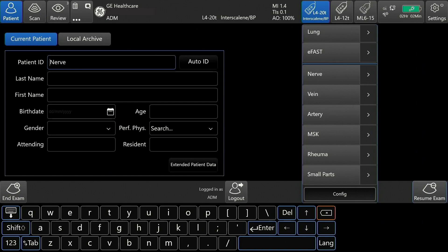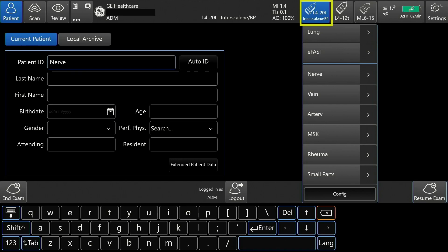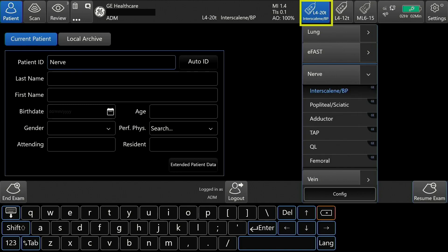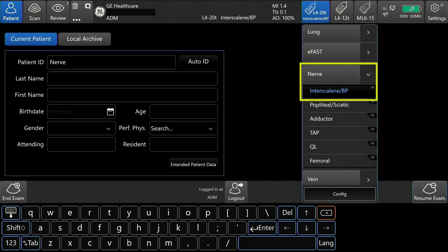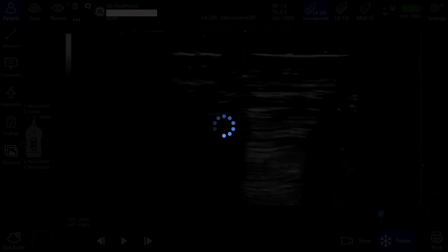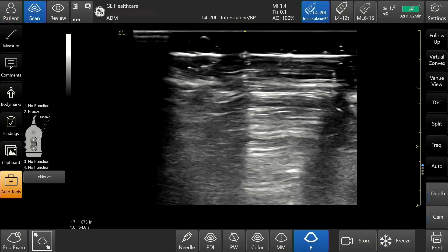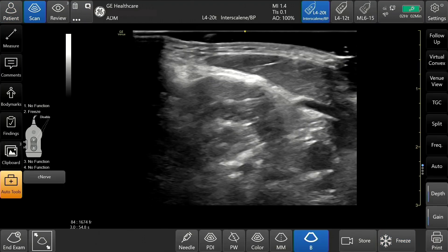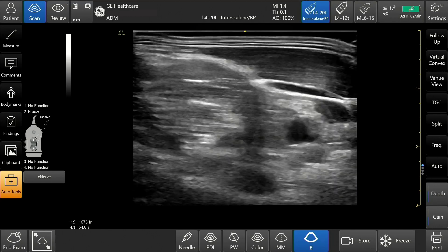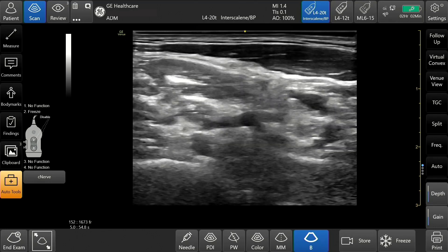To begin, select the correct probe and preset from the patient page. I will select the L4-20t probe and the interscalene preset. Scan the anatomy of interest — in this case, the brachial plexus.